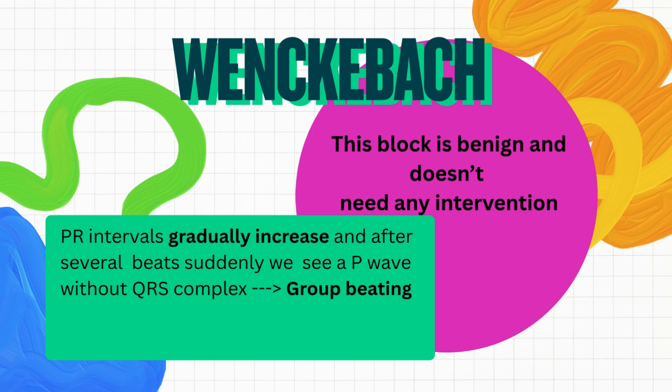This slide is about Wenckebach, or Mobitz type 1. As I told you, this type of AV block is very benign and we don't need any intervention. But we need to know how to distinguish Wenckebach on EKG. We have to understand that all AV blocks actually have a problem in the PR interval, and the PR intervals are increased in all of them.